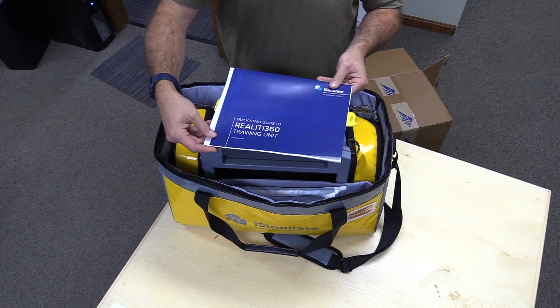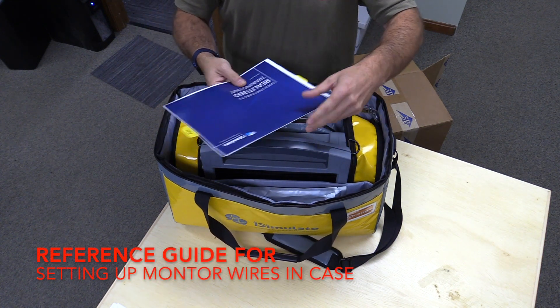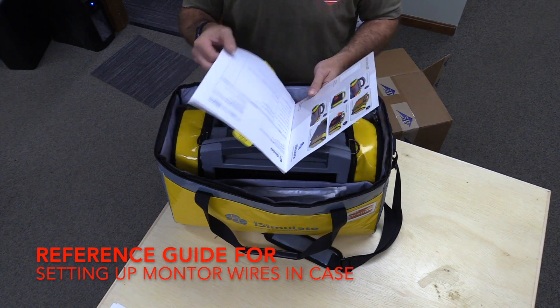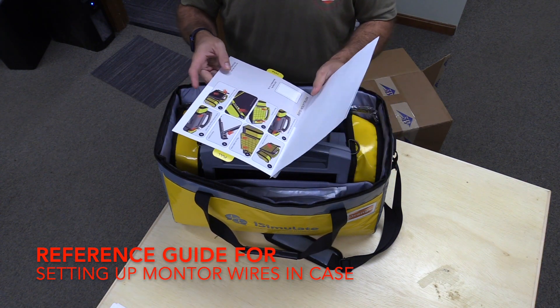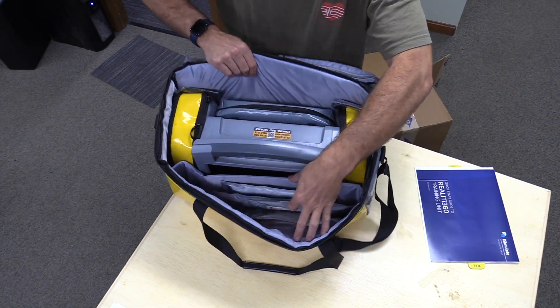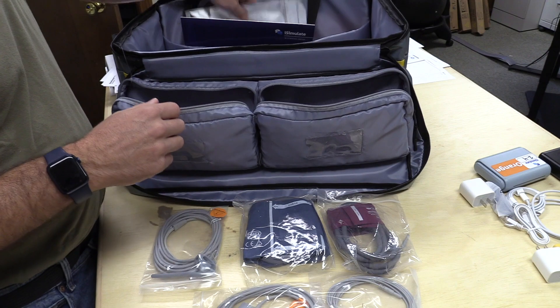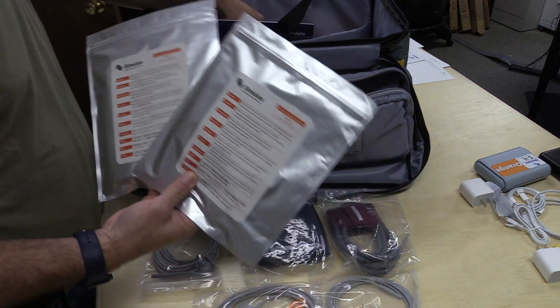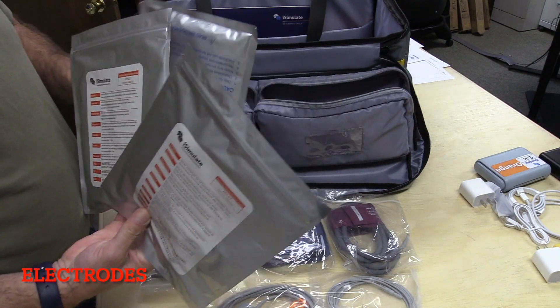On the top of your box, you'll notice a reference guide included inside and a QR code. In the front of the pouch, there are some ECG electrodes and defib pads for simulation, all of which will get put into the kit a little bit later.